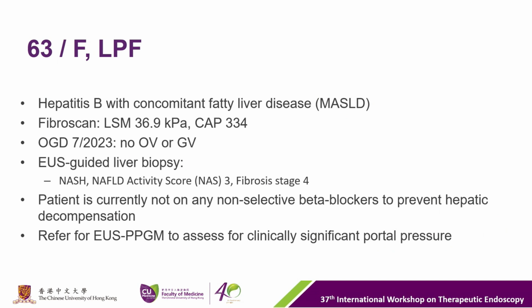For the next case, we have a 63-year-old lady, Ms. Lam, with past medical history of hepatitis B with concomitant fatty liver disease, MASLD. Fibroscan done, showing a LSM at 36.9 kilopascal and CAP at 334.